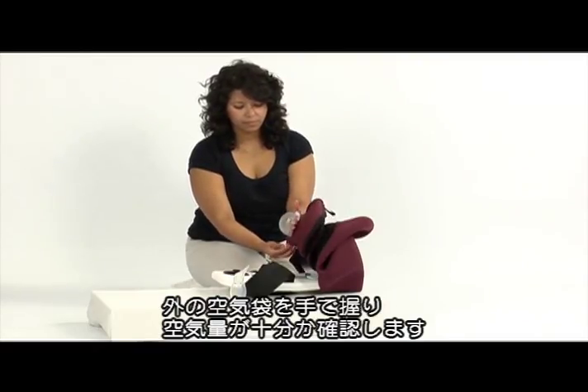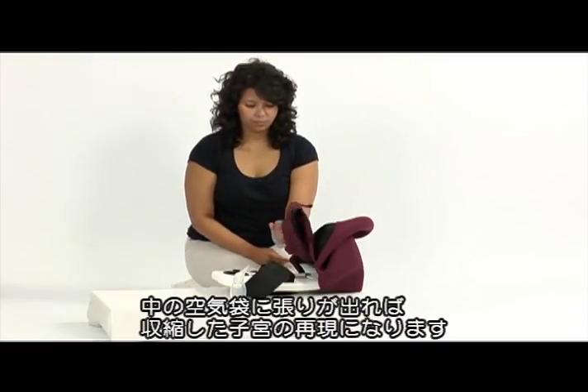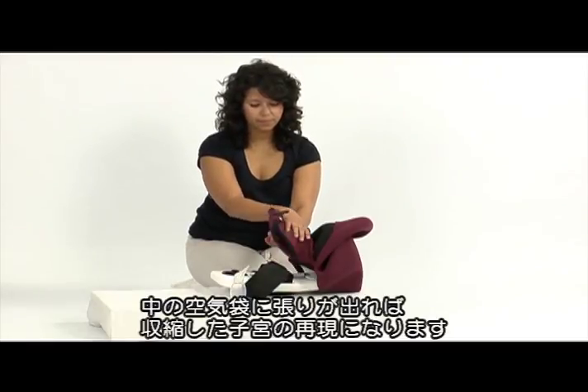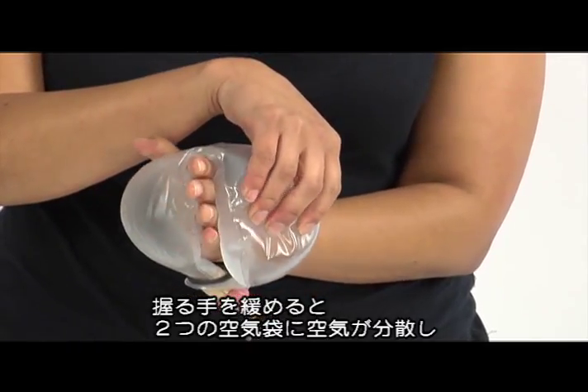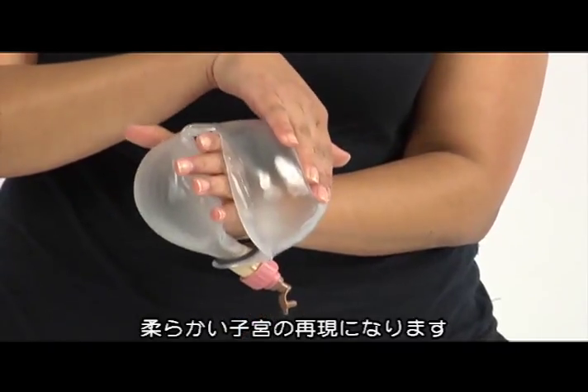hold around the visible air reservoir with your hand. The other reservoir, which normally is covered, should feel firm, simulating a contracted uterus. When your grip around the visible reservoir is relaxed, air is distributed between both reservoirs. The covered reservoir should now feel like a soft uterus.